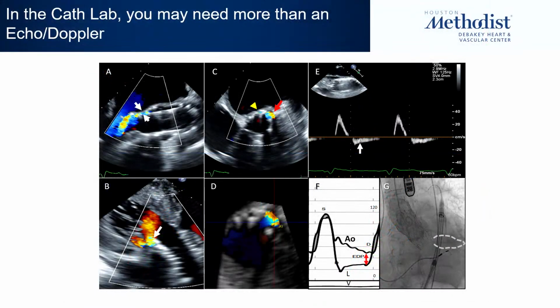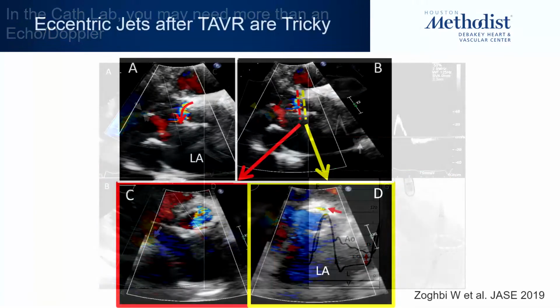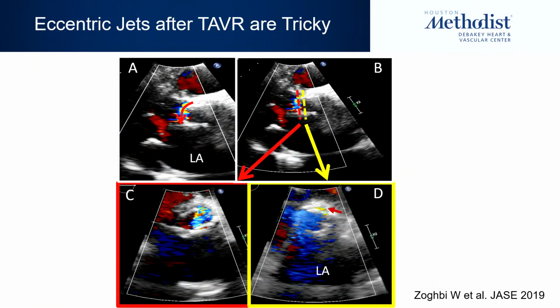Now, in the catheterization laboratory, we have several of our colleagues who are interventional echocardiographers. You're limited as to what you could use. Nowadays, we use transthoracic much more often than transesophageal, but besides color and some reversal of flow in the aorta that you've done before and after, use hemodynamics, and not infrequently, if you're concerned, you would use some angiography to try to determine whether you need further expansion or another manipulation.